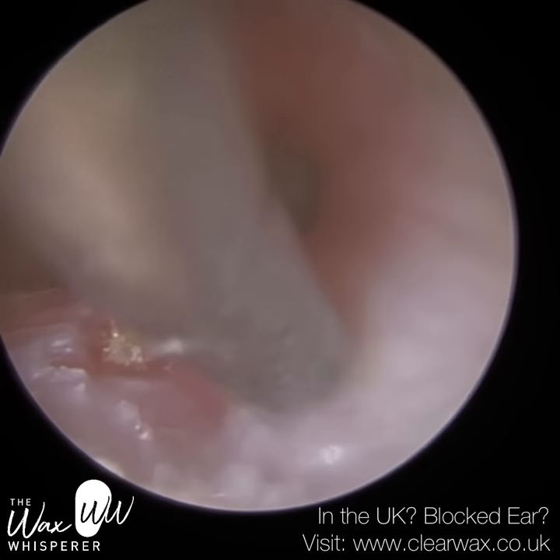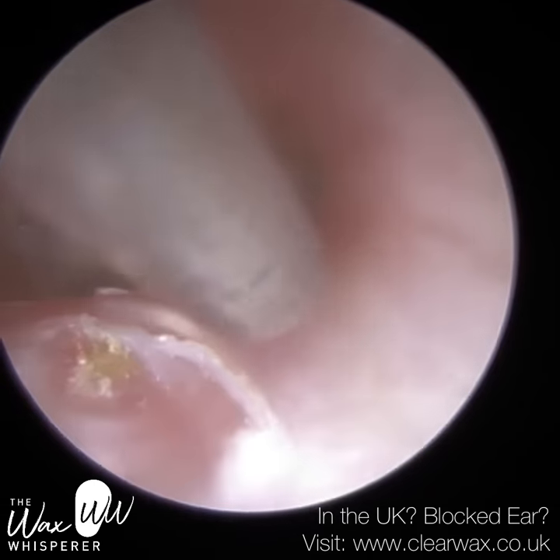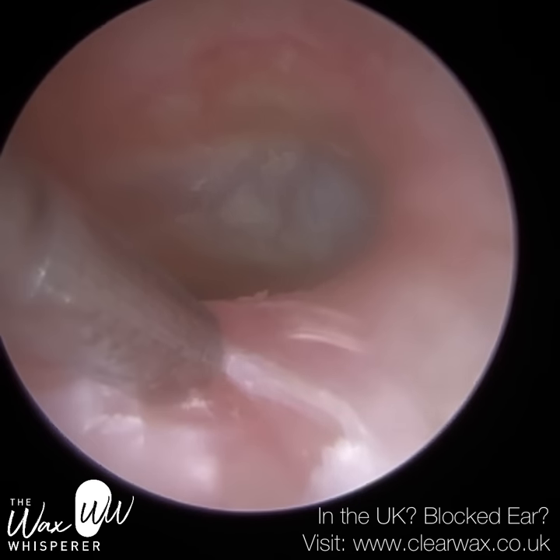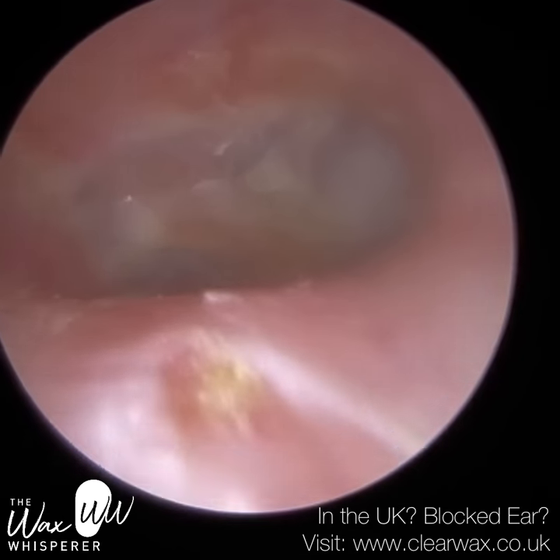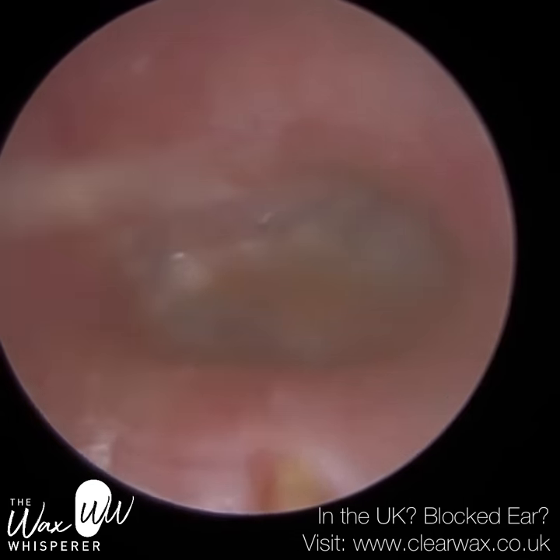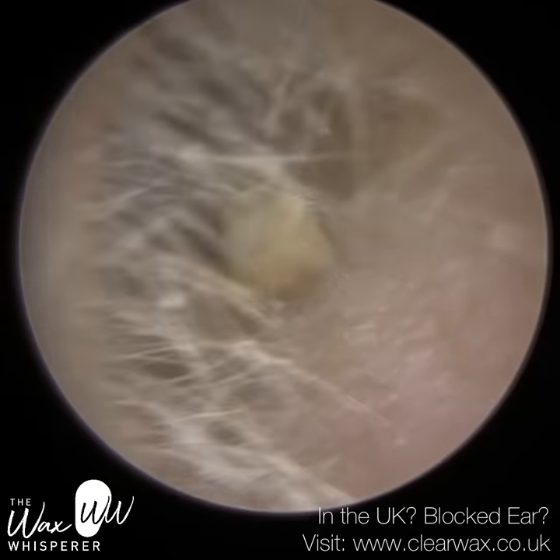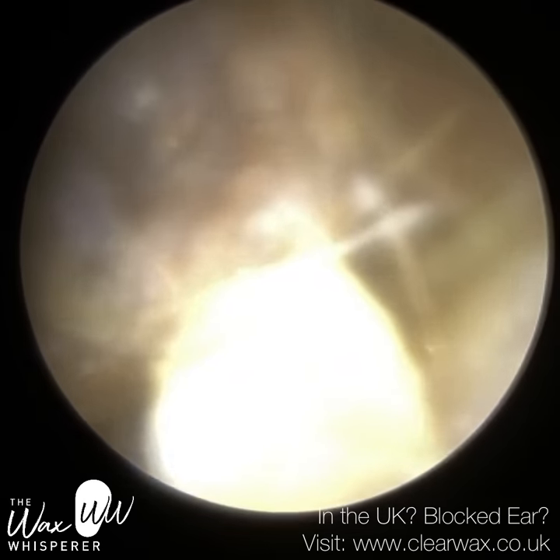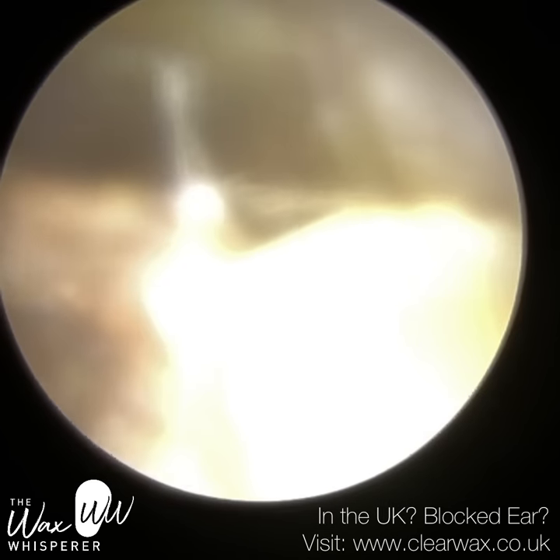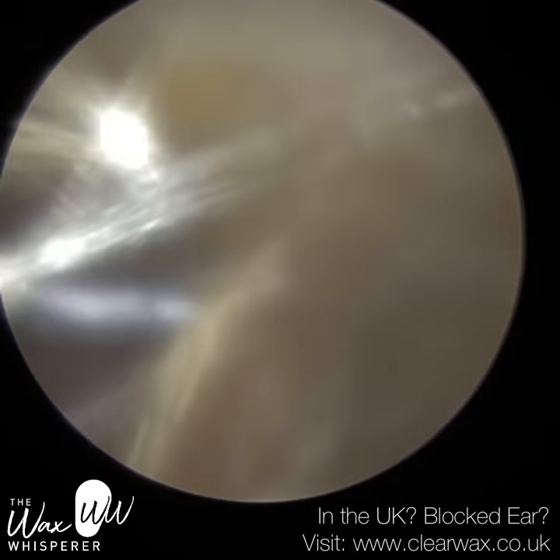You can see that keratin — I've tried to remove it and it's almost like a pothole in there, so it definitely needs further investigation. We don't know how deep and aggressive this buildup of keratin is. I just tried to chisel it, but it was becoming a bit uncomfortable for the patient so I stopped at that stage. We wouldn't have noticed it if we hadn't removed the skin — if I had left that initial plug, we would probably have missed this buildup of dead skin and it may have got worse.